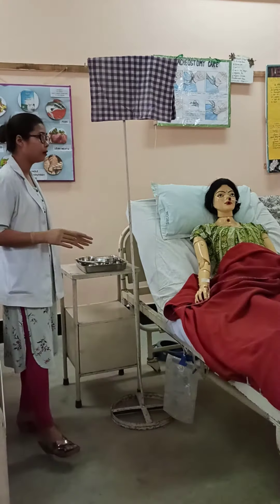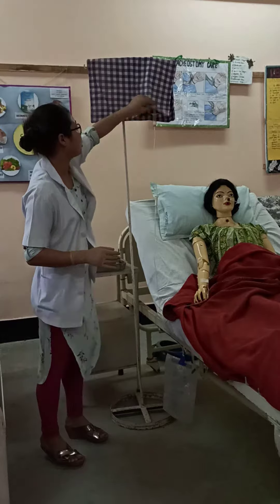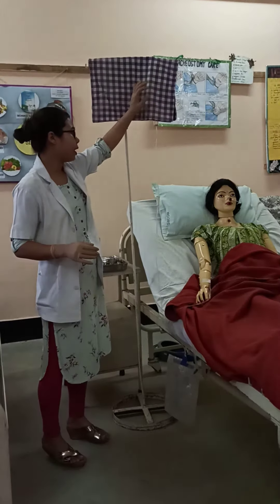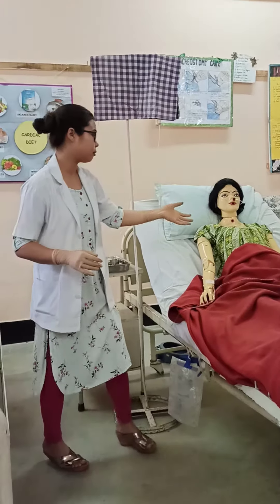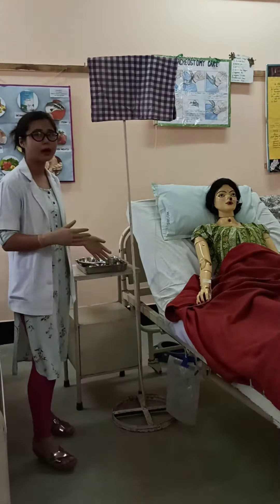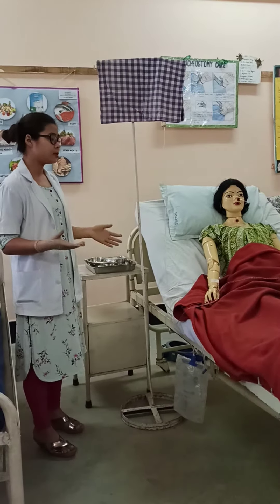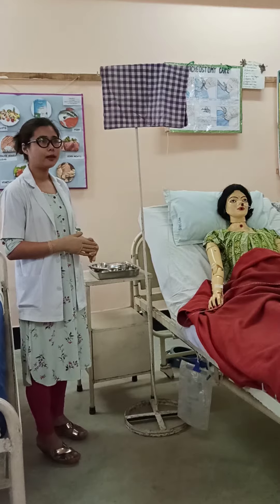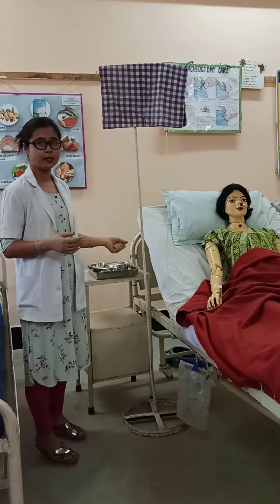During the procedure, cover the blood bag with a towel, and before giving the blood, always cross-check with other staff, which includes the blood type, the expiry date, and the unit number, and also the doctor's advice.